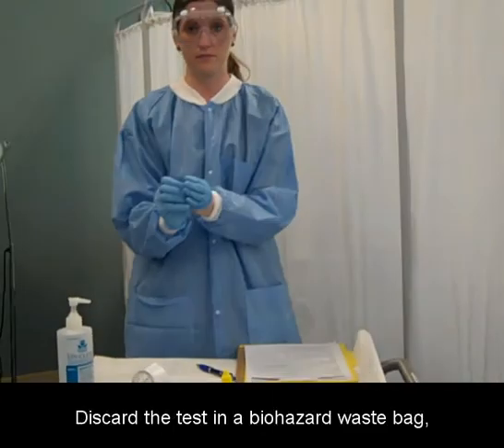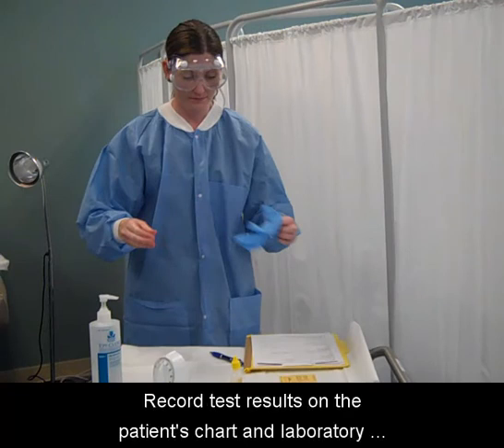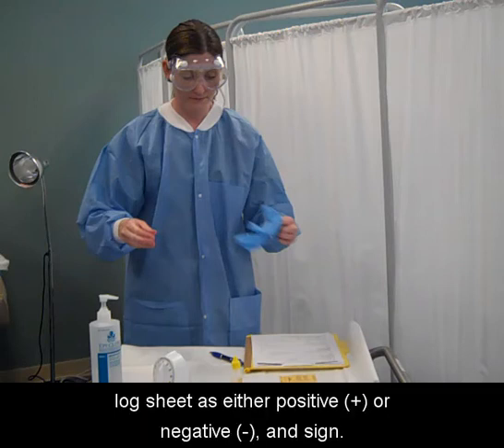Discard the test in a biohazard waste bag, remove gloves, and wash hands. Record test results on the patient's chart and laboratory log sheet as either positive or negative and sign.